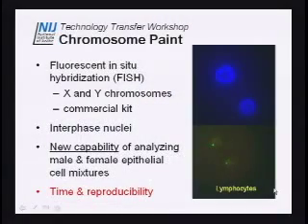Most of these genetic areas are associated with some type of disease or genetic mutation or something like that. However, there is one that's sold that's used for identifying the X and Y chromosomes. This is sold to identify bone marrow transplants, primarily the repopulation of the recipient in a different-sex bone marrow transplant. That's how you would use this. This is, again, FISH. It's got the X and Y probes. It's used for interphase nuclei. You don't have to, as you used to years ago, go to the metaphase, using something like colchicine to stop them at the metaphase point, but this is used for interphase nuclei.